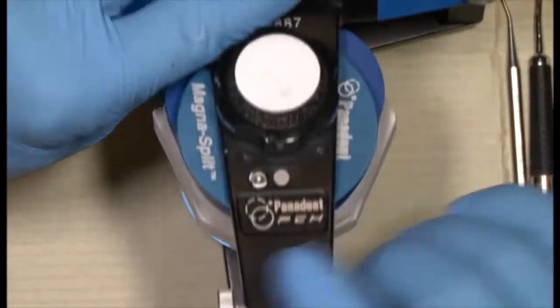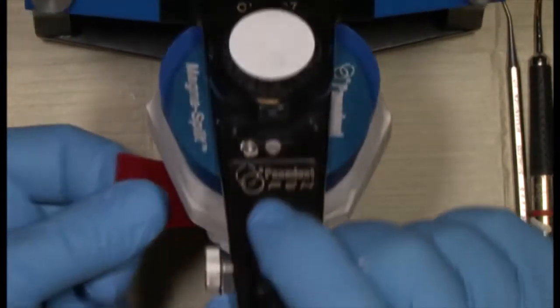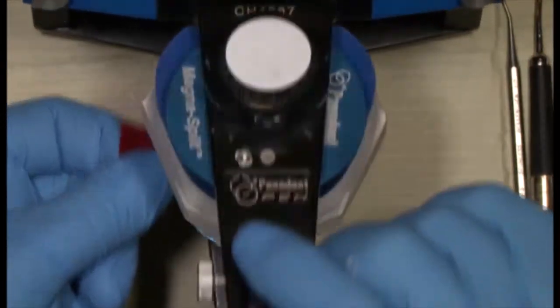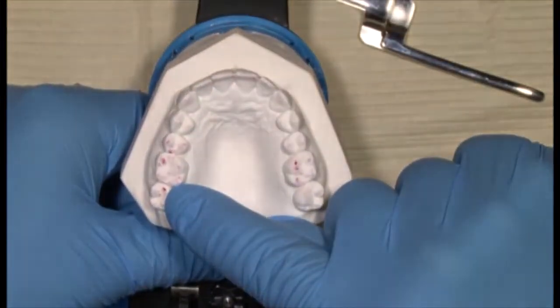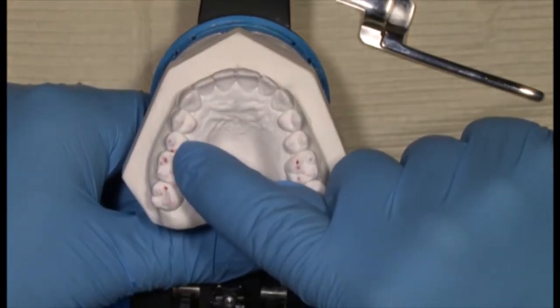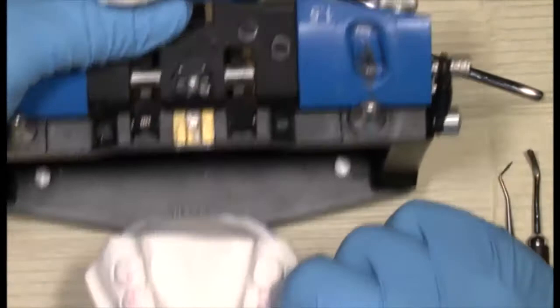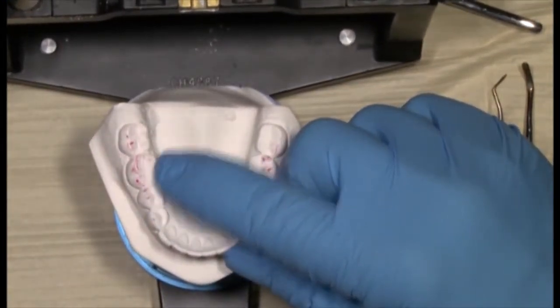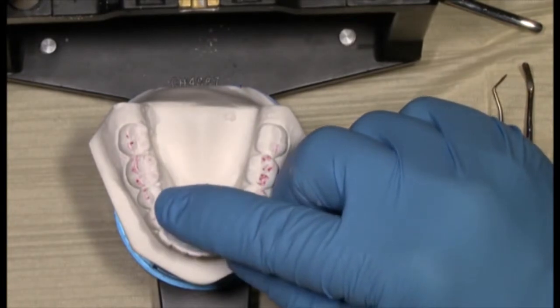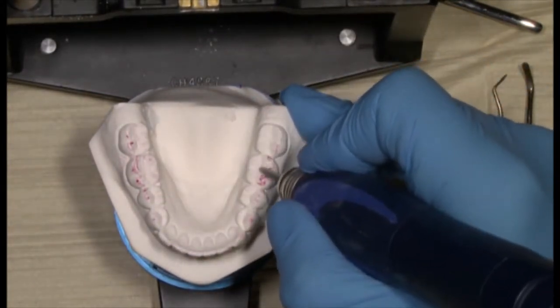This side doesn't really touch, it just smudged. I'm just getting it to hit. Now it's starting to contact here. This almost fossa type incline, you look at the bottom, it's a little bit on that buccal cusp right there. So let's start to work through this. I'm just going to take these marks away.